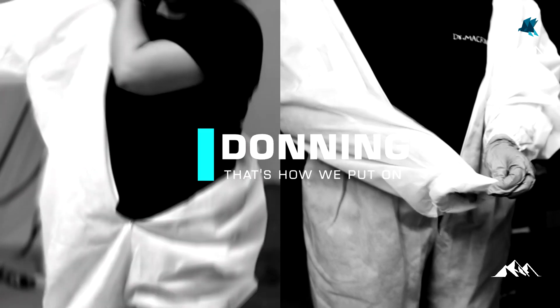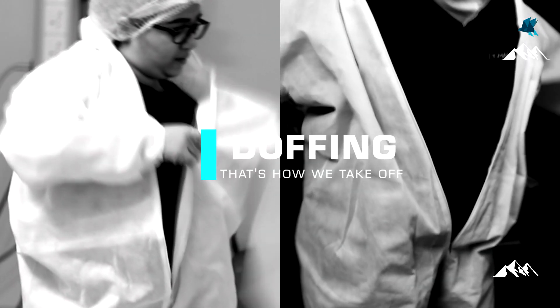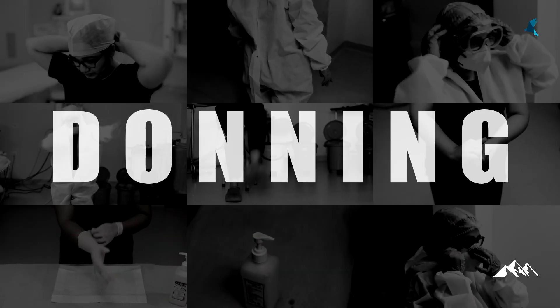Now to the steps of putting on a PPE, also called donning, and how we remove the PPE, also called doffing. Stepwise if we look at donning, it includes the following steps in sequence.